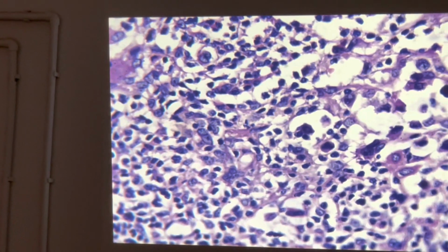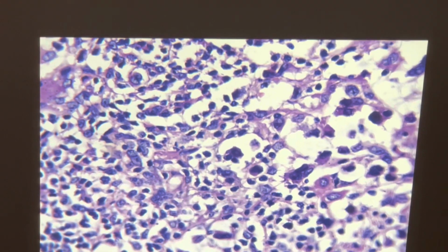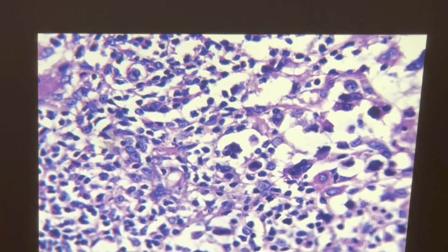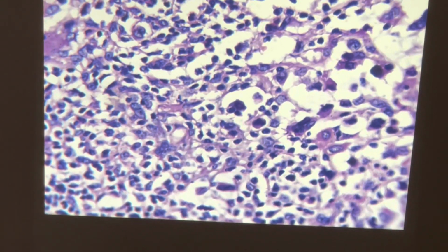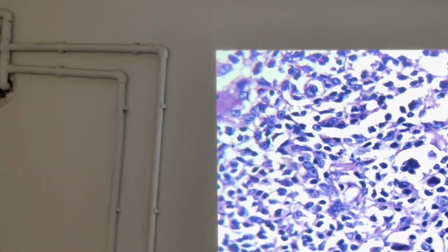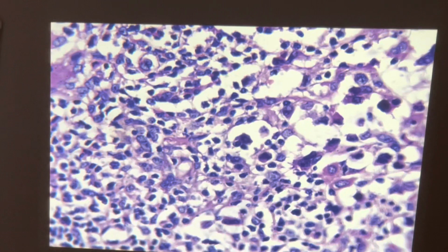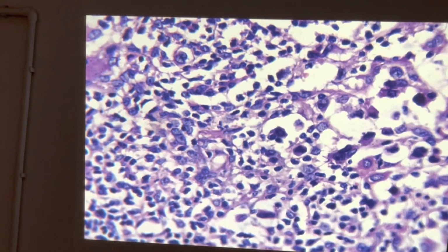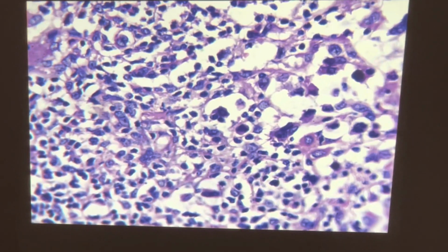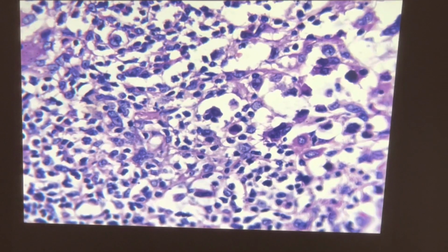The lymphocyte usually is a spherical cell. What about the nucleus? What's interesting in the lymphocyte is the shape of the nucleus. They have what? Yes. They have a compact nucleus, and this nucleus replaces the entire cytoplasm. Only a small ring of the cytoplasm will remain. Dark spot. Lymphocyte usually what? Dark spot. Take a look. All of this is what? Is a lymphocyte.